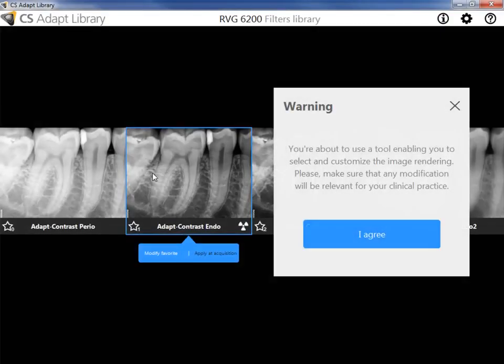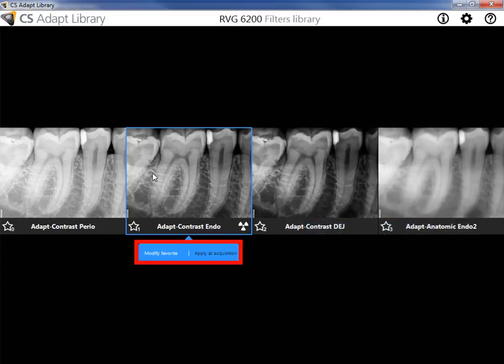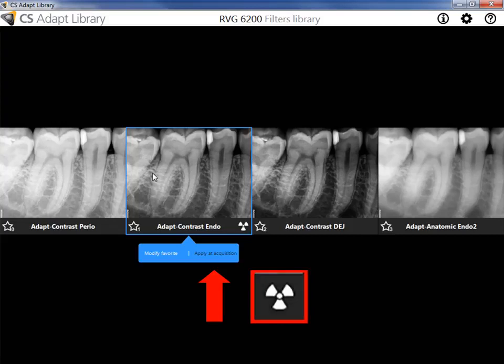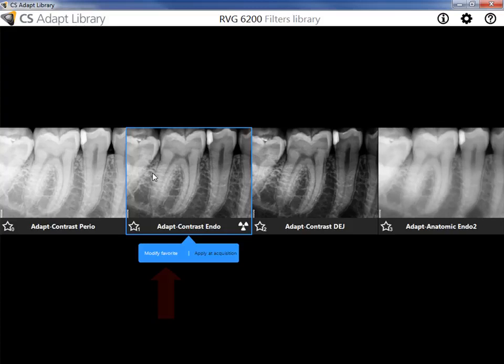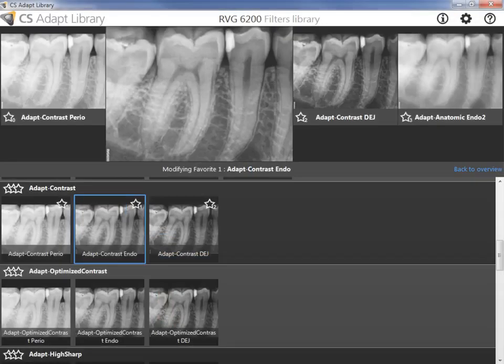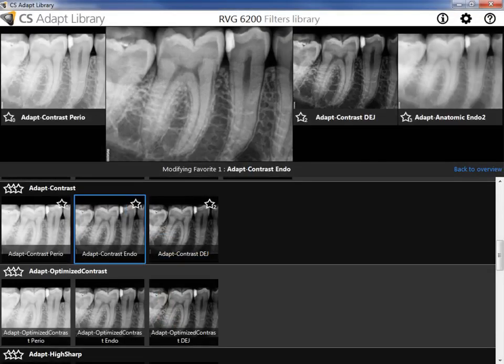When the CS ADAPT library opens, accept the warning message or close. Select a favorite to modify or apply at acquisition. When a filter is selected to apply at acquisition, the X-ray symbol will be displayed in the bottom right corner. When you select to modify a favorite, the filter library is displayed. Note the following parts of the filter library.